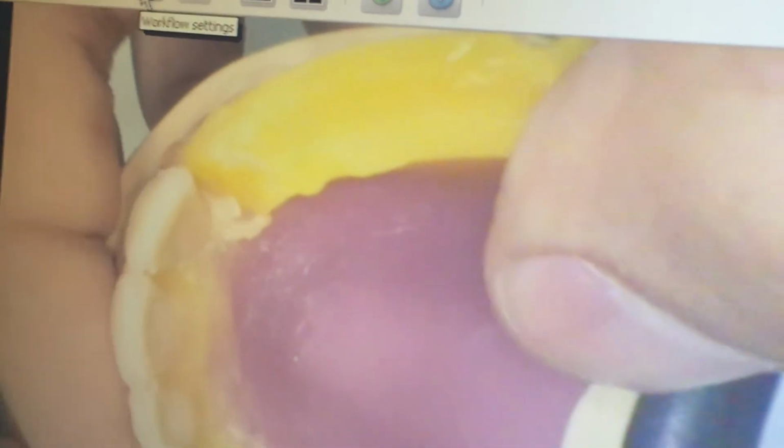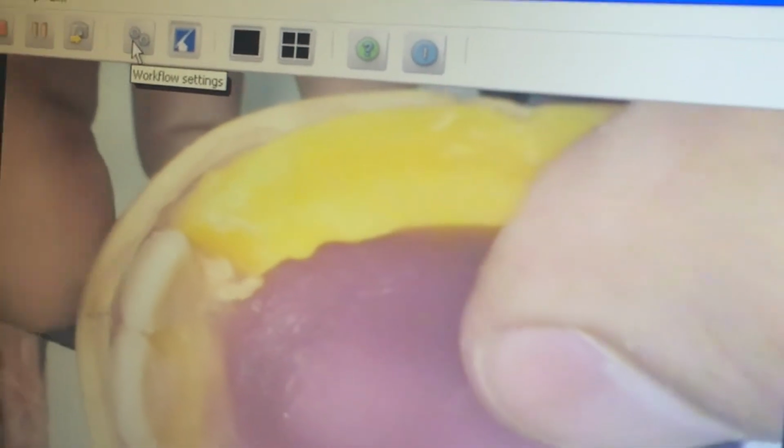This side. Here, the two necks are on the same level. And if you see, this neck is going a little bit deep. صح? And these two necks are on the same level. So I have to go to the other one.